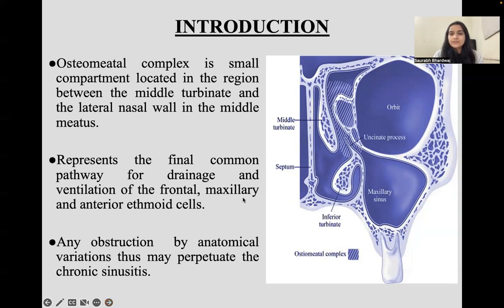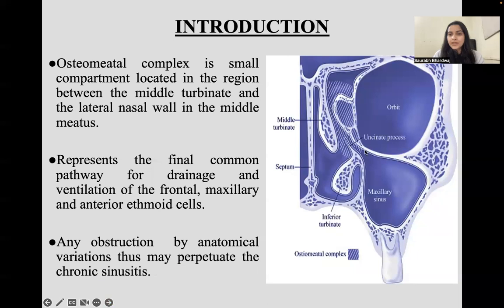In this image we can see the orbit, the medial wall of the orbit, the middle turbinate, the middle meatus, the nasal septum, the uncinate process, the inferior turbinate, and the maxillary sinus.